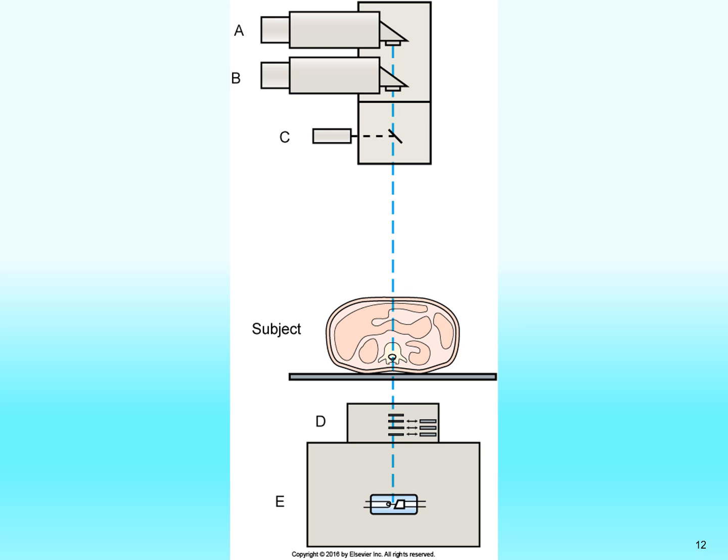Okay. So this is how our machine is set up. We have X-ray tube letter E. Notice that looks like a stationary anode Coolidge tube to me. We don't need a rotating anode because we're going to do like 2 exposures and then we're going to rest the machine for about 15 minutes or so.